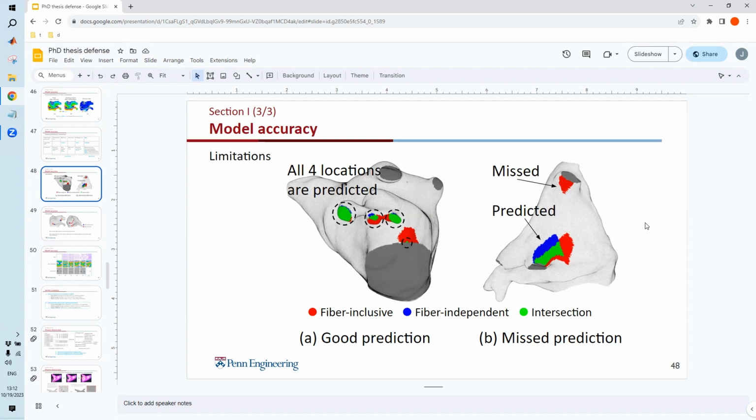When physicians use this model, we rarely need to access these maximum error regions, because they can be handled in the next ablation mapping iterations. As more and more ablations are done, the atrial rhythm becomes closer and closer to sinus rhythm. I see. So after every ablation, a remapping is performed?